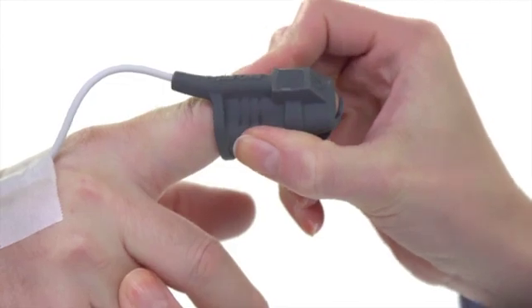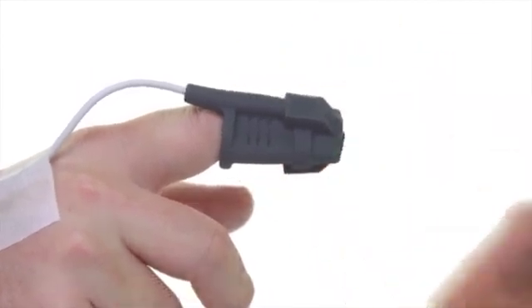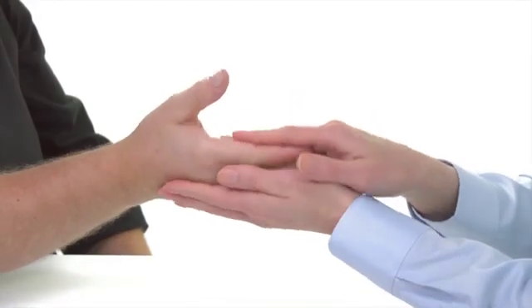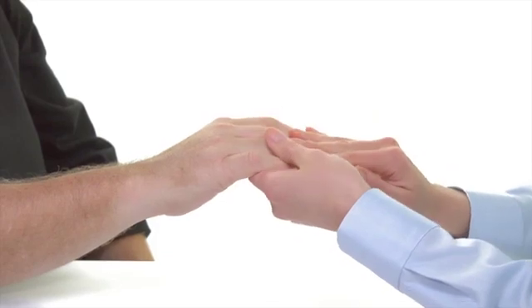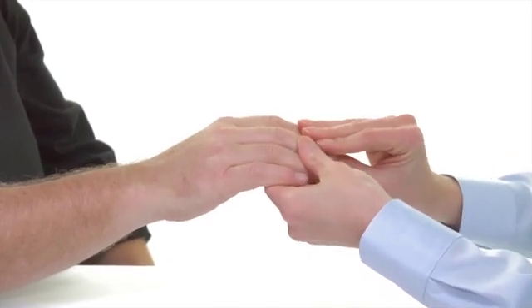Reposition the sensor to see if a stronger signal can be obtained. If repositioning does not increase the signal quality, try a different site or check that the patient's hand is warm, relaxed, and well perfused.